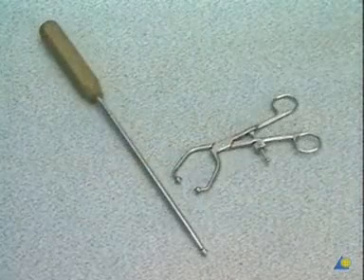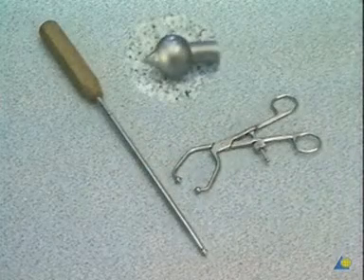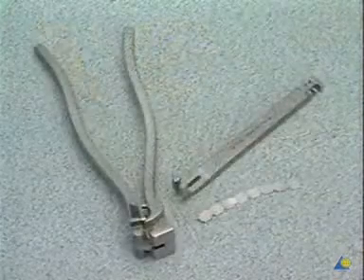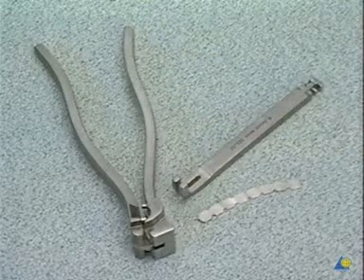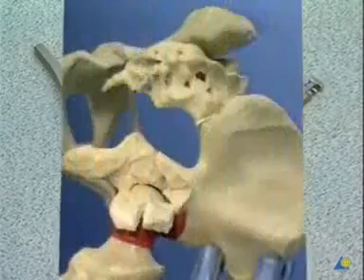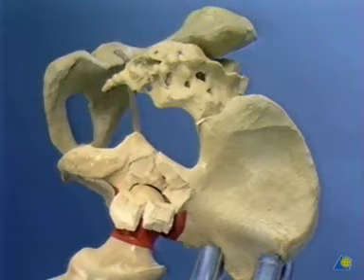The fragments are held in place with the small oblique pelvic reduction forceps and the bone holding rod, both with pointed ball tips. The template serves as a model for bending the plate with the bending pliers for reconstruction plates and the bending iron. Place the pelvis in the vise as if the patient were in the prone position.